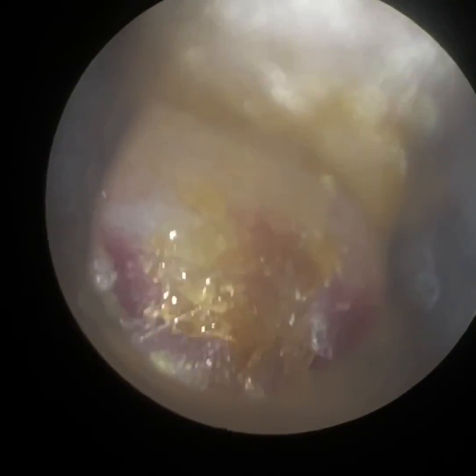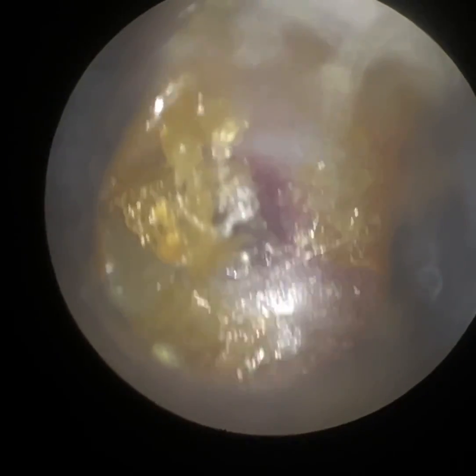So again, just using the hook, just bringing this forward. Interestingly, once I remove this wax and keratin plug, the patient has got acute otitis media with effusion here. That's the eardrum — you can see it's really red and inflamed and it's actually bulging out.